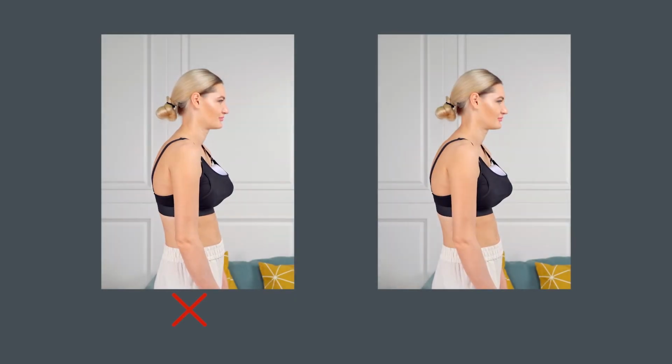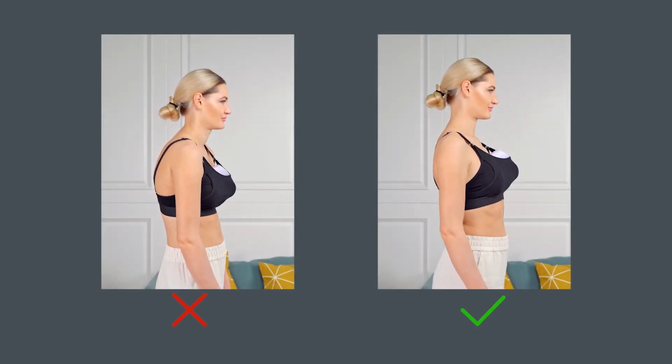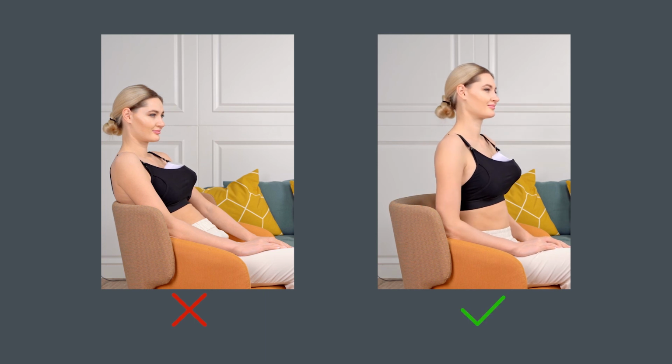When using a breast pump, you need to maintain an upright posture, avoid excessive forward or backward leaning, and avoid milk leakage.